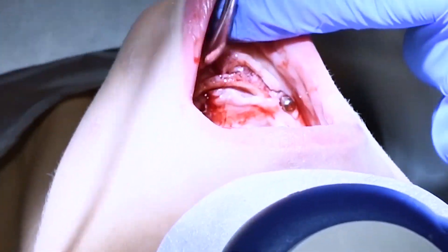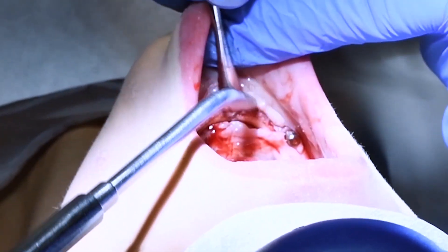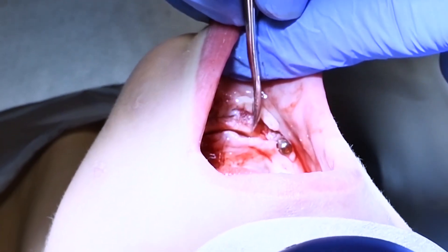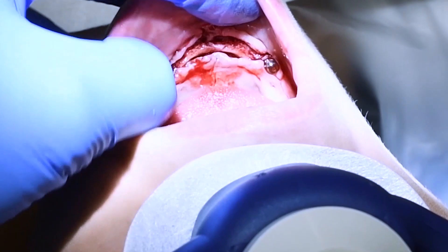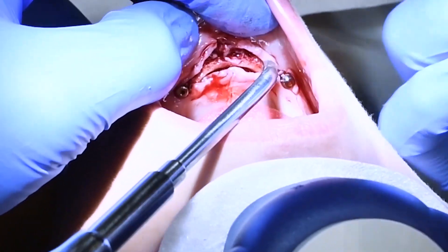I want to retract the tissue a little bit on the inside, which is called the lingual — towards the tongue. This is the lower jaw that you're looking at from above. We're moving that tissue back so we can see the surgical site.